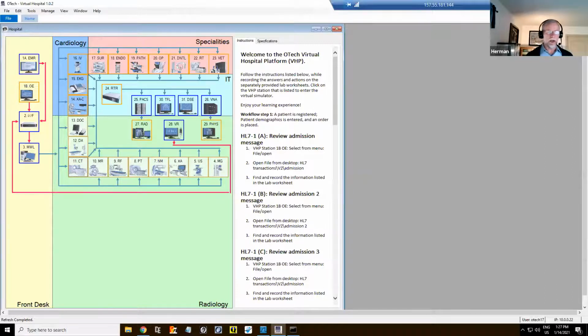It's a test environment that allows me to run different simulators, and in addition to simulators, I can also run different tools. Basically it's in the cloud. I just added RDP earlier, so there's an RDP remote desktop into the cloud, an Azure cloud.